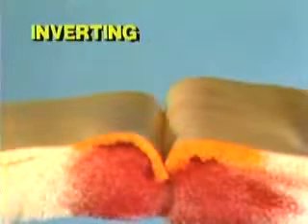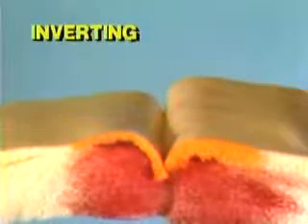Second, inverting, turning tissue inward toward the patient or toward the lumen of a viscus. Third, everting, turning tissue edges outward toward the surgeon.